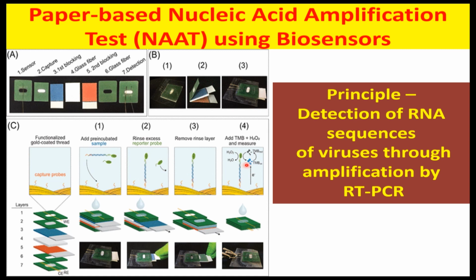Okay, so first the amplification of the RNA is done. The RNA sample is made incident onto the capture probe. The capture probe captures the sample, then we visualize the sample. If that particular RNA is present within the capture probe, it means that RNA is present in the sample also, and the patient is rightly diagnosed.